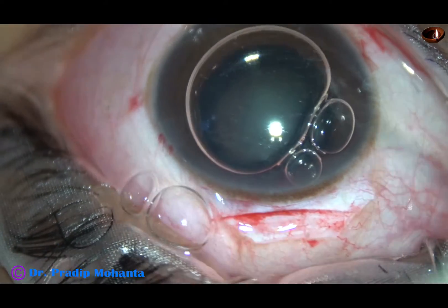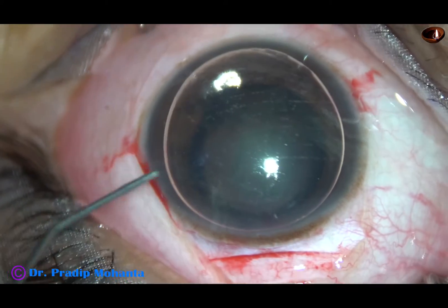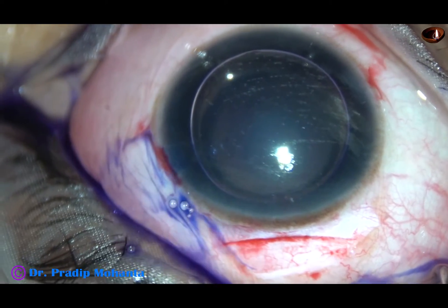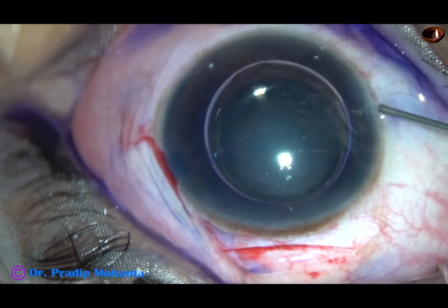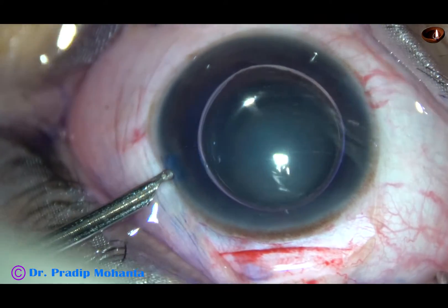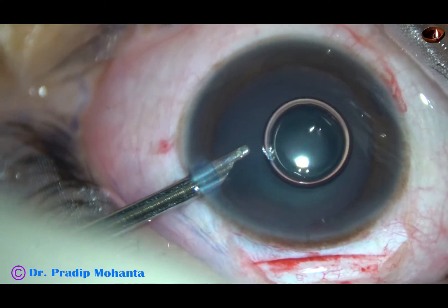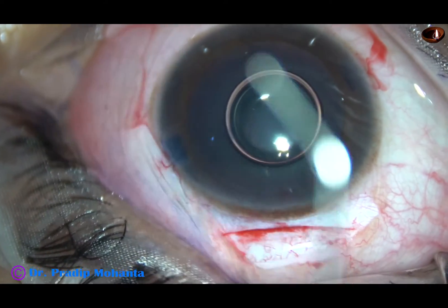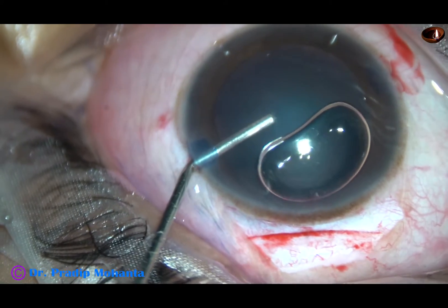An air bubble is injected. Beneath this air bubble, trypan blue dye is applied over the anterior capsule. And now the dye is washed out with a 23G Simcoe cannula. Then 2% hydroxypropyl methyl cellulose is used to fill the anterior chamber.